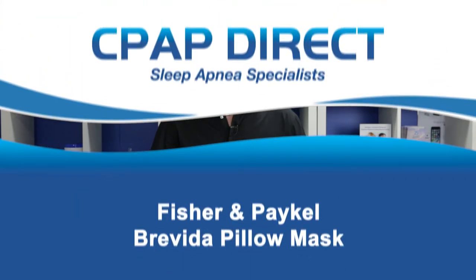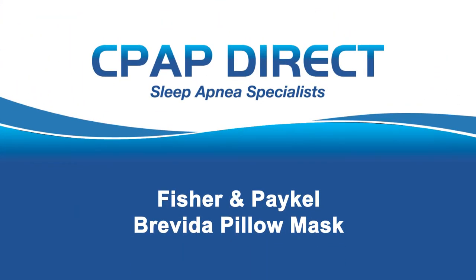Hi, I'm Bryce Perrin from CPAP Direct. In this video, we're going to do a review on the new Brevida pillow mask by Fisher & Paykel. The pillow mask that Fisher & Paykel had before this one was called the Pilairo, and the Pilairo was okay, but there were a few design flaws which have been completely addressed in the new one.